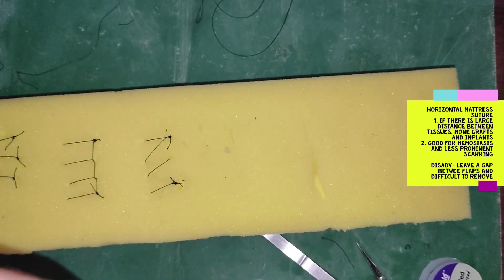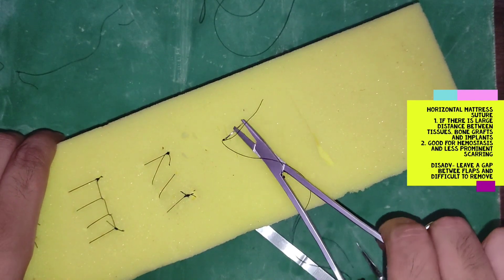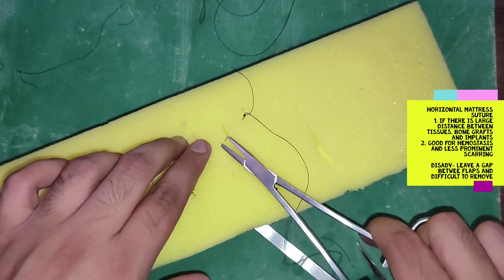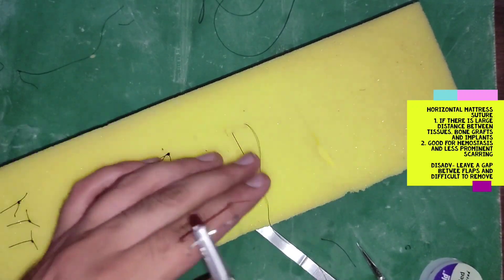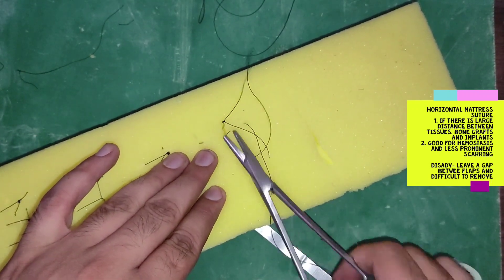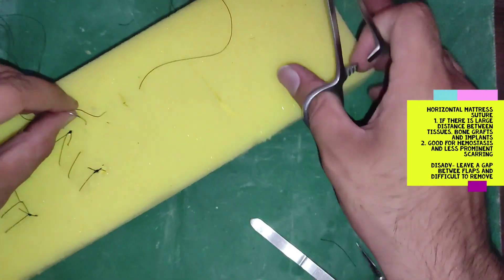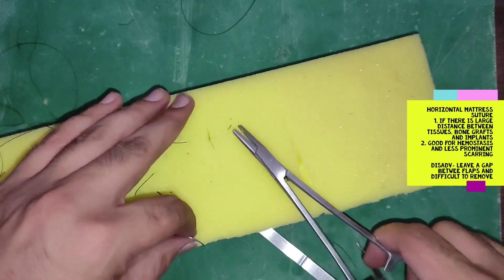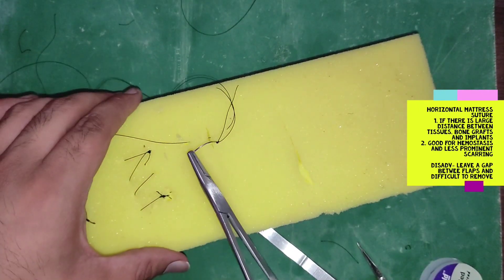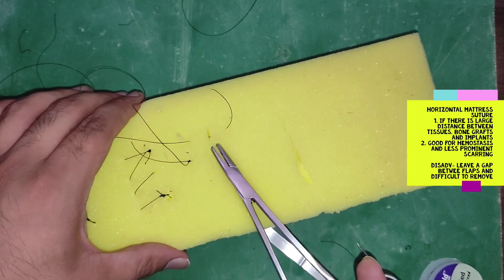The next technique is horizontal mattress suture. The first step of all suturing techniques is the same — remember that. After the first pass, instead of tying a knot, you continue suturing to complete the horizontal mattress pattern.